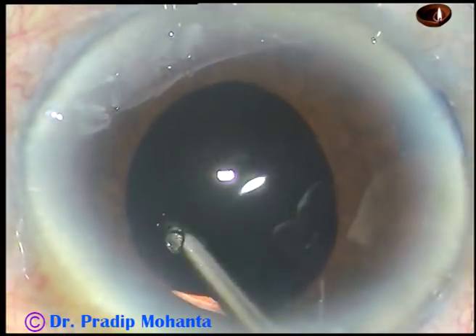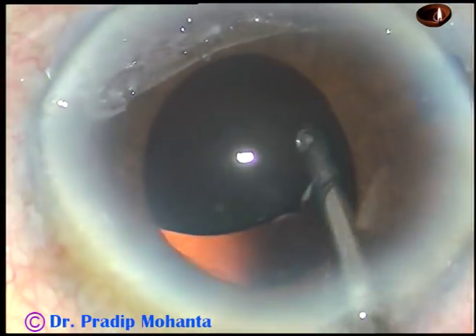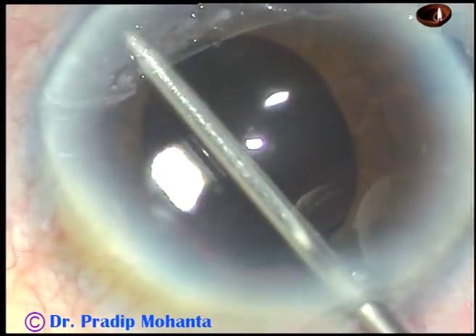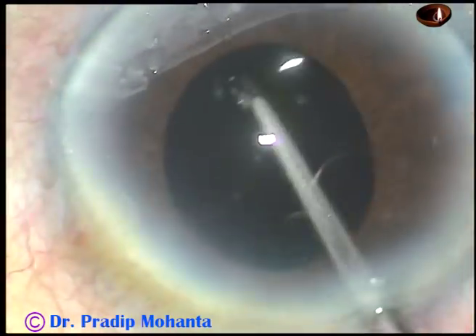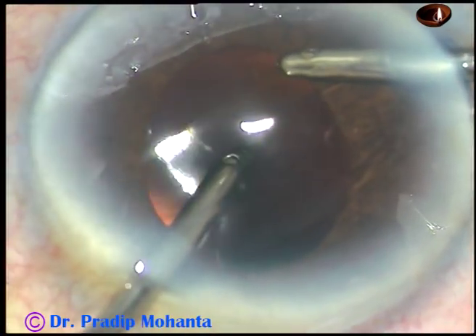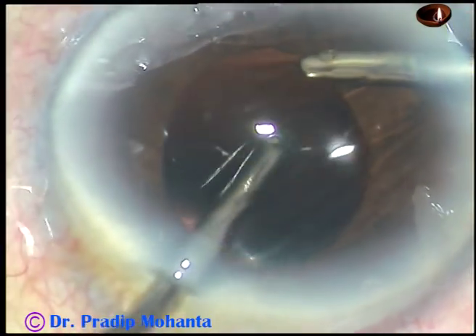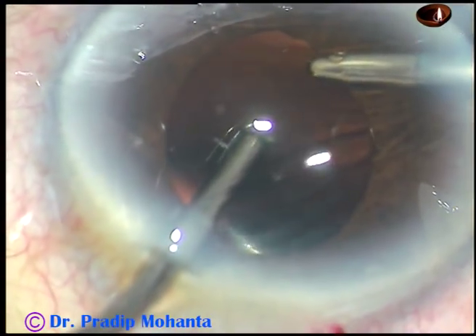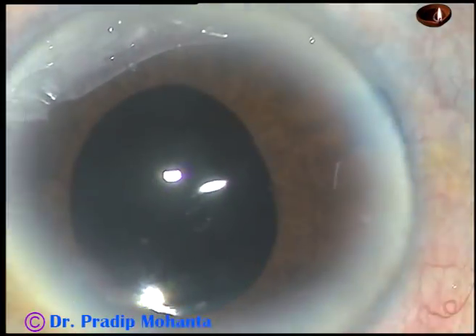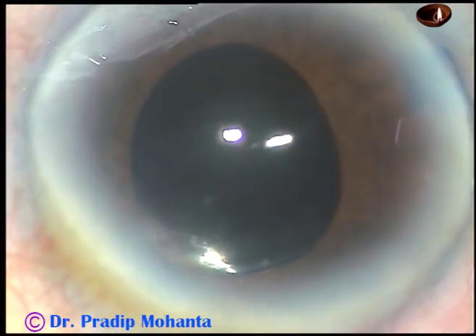The rhexis has been covered by the optic by this time. I am cleaning the viscoelastic substance thoroughly, irrigating the capsular bag, the anterior chamber, and the anterior chamber angle. We must thoroughly clean the viscoelastic substance, because otherwise there can be a rise of intraocular pressure in the postoperative period and the patient will not feel comfortable.